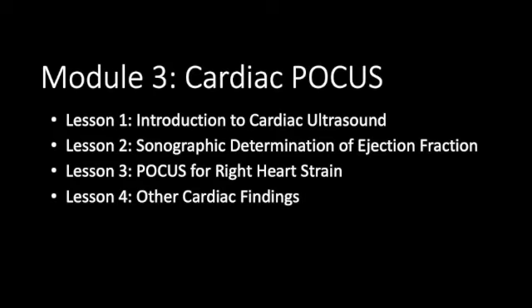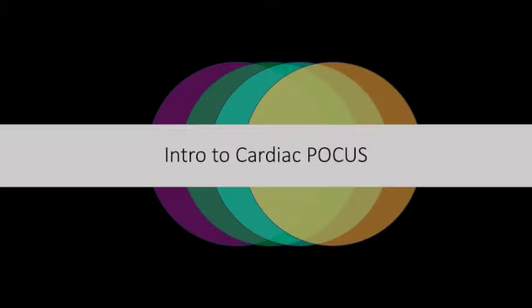Now, as you know, our residents practice in a variety of settings ranging from outpatient focused practices to full-time hospitalists and sometimes even critical access ERs or ICUs across the country. So my goal is to focus on a variety of both inpatient and outpatient applications of POCUS for cardiac complaints and clinical questions. Our first lesson will focus on the basic techniques and standard imaging windows used to evaluate the heart using bedside ultrasound.